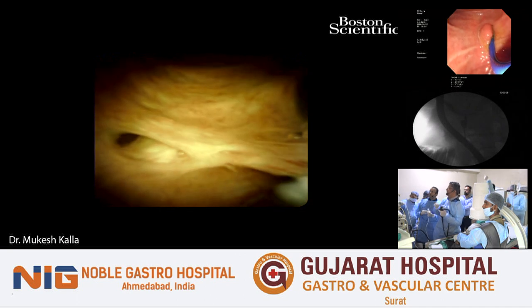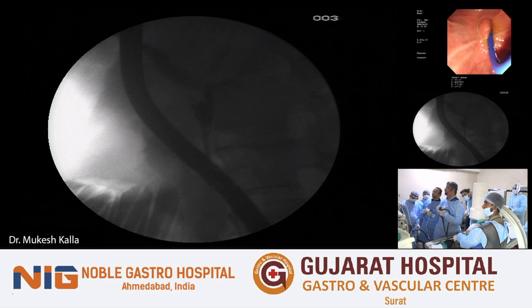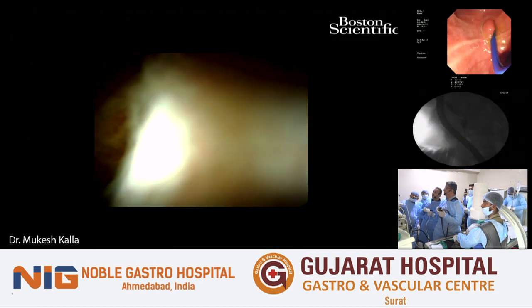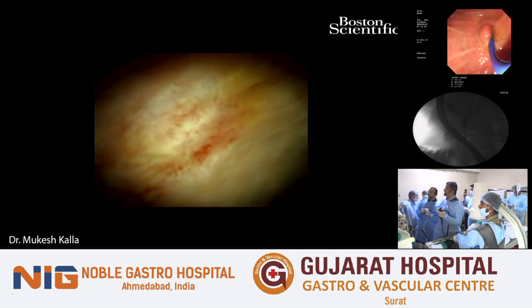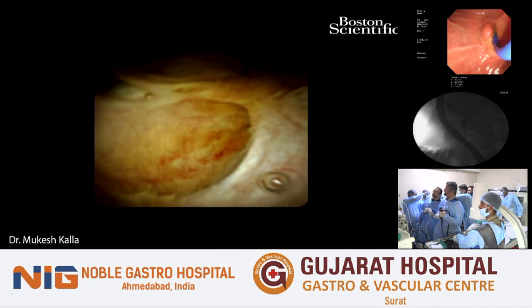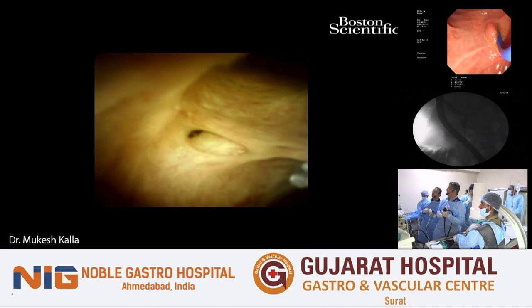Okay. So this is the hilum. We can see. Show the CM also. Bring it in the middle. This is mucus. We will put in water. So this patient had two stents placed earlier. So some amount of induration and fibrosis you can see here. This small hole is probably, I presume, let me check, might be the cystic duct.